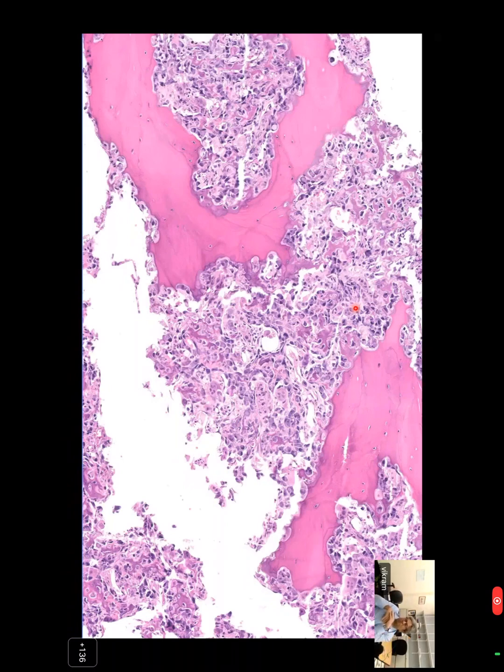At that point, I don't particularly care what the radiologist tells me. Oh, and then the tumor should be stuck to the lamellar bone. You want to make sure that it's not sort of being pushed there during the surgical procedure. And at that point, I don't care what the radiologist tells me. That is diagnostic for an osteosarcoma.